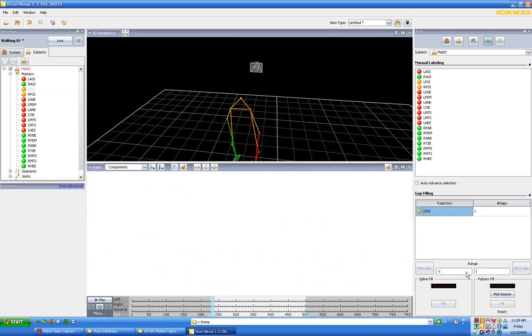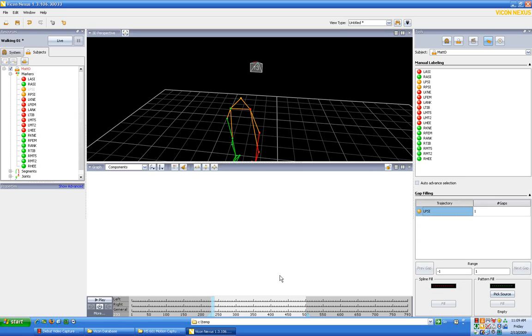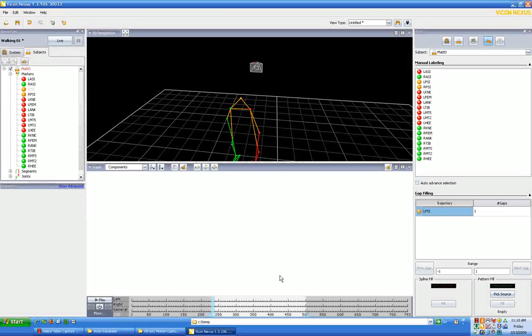We can either use spline fill or pattern fill. What spline fill does is it takes an average of the coordinates from where the dot was last known into where it reappears again. That's just going to do an averaging, and that's good for small gaps.